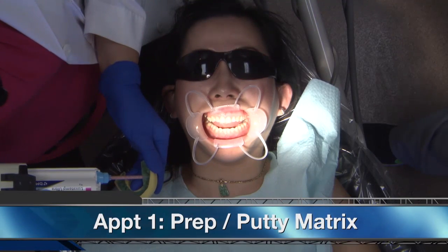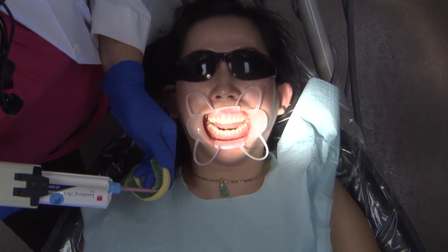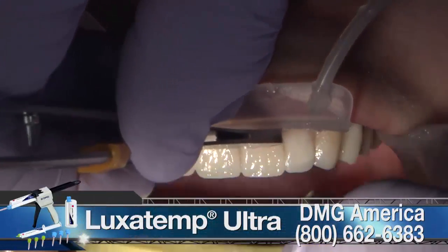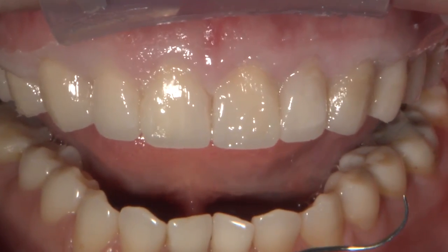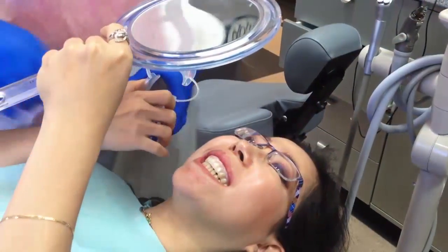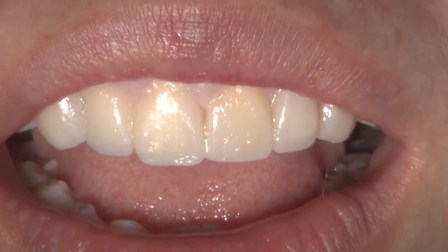To demonstrate the possibilities for improving the patient's smile, a cosmetic resin mock-up was performed chairside at the consultation appointment. Using the diagnostic wax-up, the mock-up was done using a putty wash impression matrix, and after injecting laxatemp material, it was placed in the patient's mouth. After the patient had the opportunity to look at her smile, the decision was made for 10 obsidian veneers with the centrals longer than the laterals. After the gingiva healed from surgery, another pre-evaluating set of temporaries was used that took into consideration the gingival repositioning.